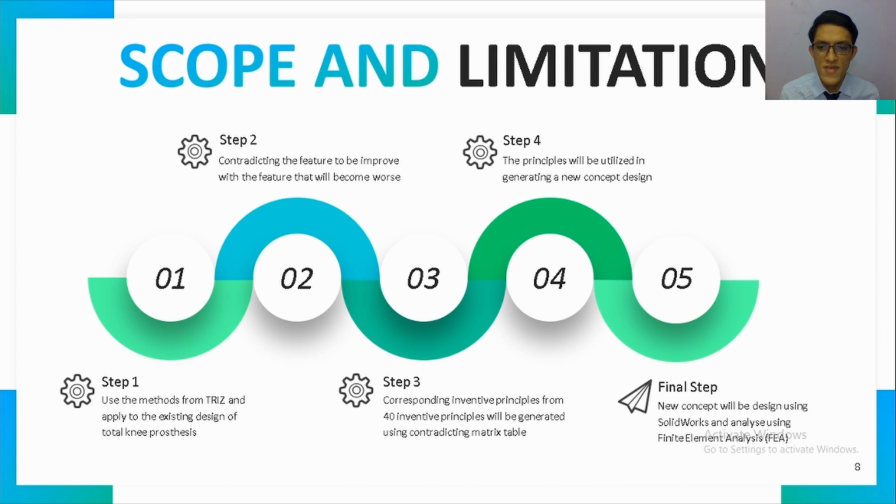The scope of this project is to create a new design of high-flexion total knee prosthesis using the theory of inventive problem-solving. The aim is to use the methods from Triz and apply them to the existing design of total knee prosthesis. The solution from Triz will be used, which comes from contradicting the feature to be improved with the feature that will become worse. Using the contradiction matrix table, the corresponding inventive principles from a total of 40 inventive principles will be generated, which will be utilized in generating a new concept design.